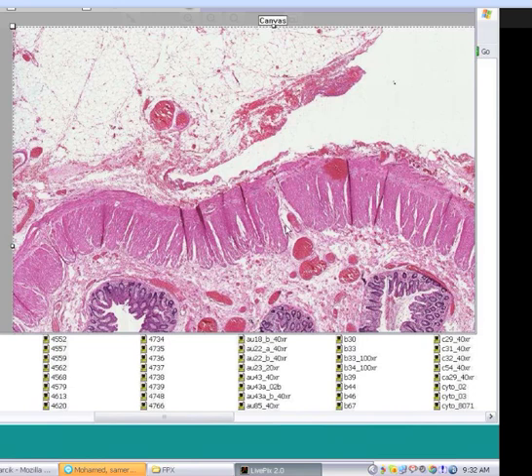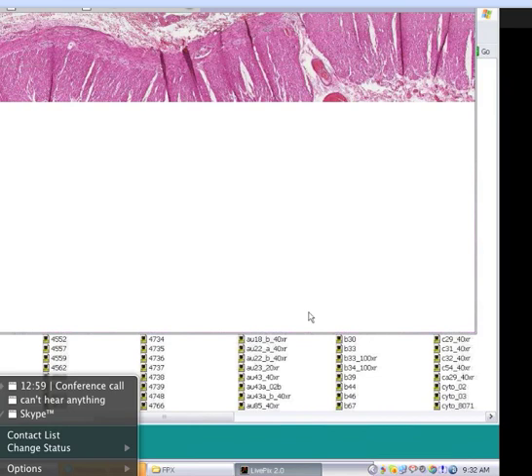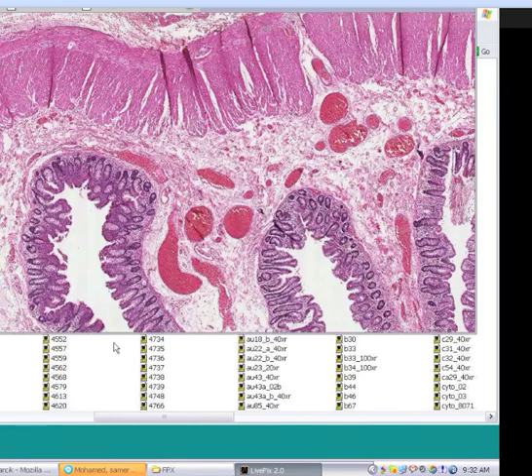So having said that, let's take a look at this. I wish I could show you more of it because this is a pretty simple, straightforward case. So I'm going to blow it up. In about 5 or 6 seconds, I'm waiting for a couple people to say, I see it. Okay, good.